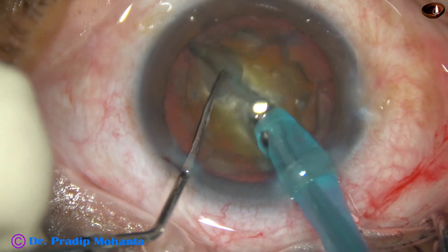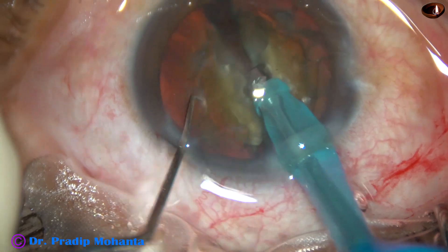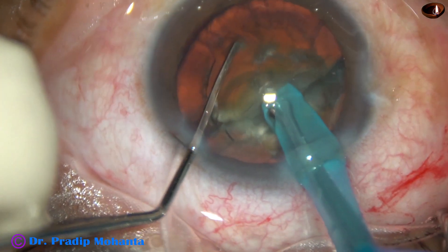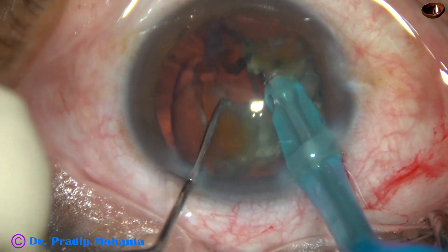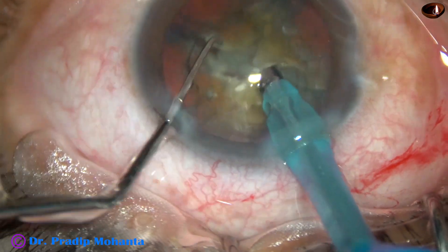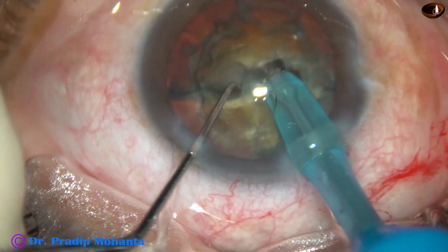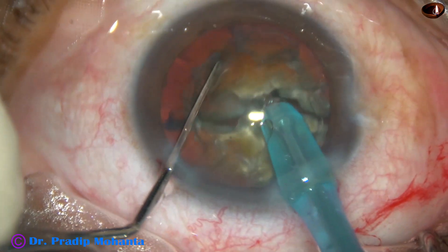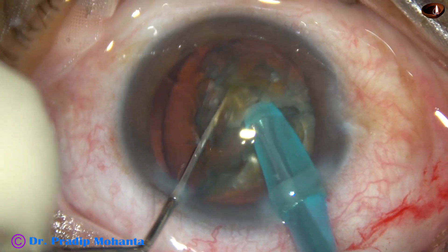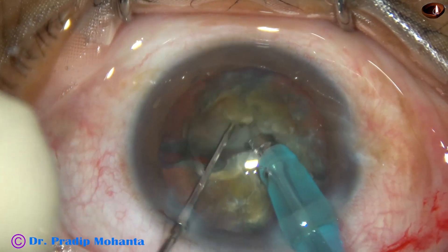It is rotated 180 degrees and the two pieces are completely separated from each other. Each large half — that is, each hemi-nucleus — is subdivided into two large fragments. The tip goes through the lens matter, is held very firmly, and the chopper divides the hemi-nucleus into two large fragments.